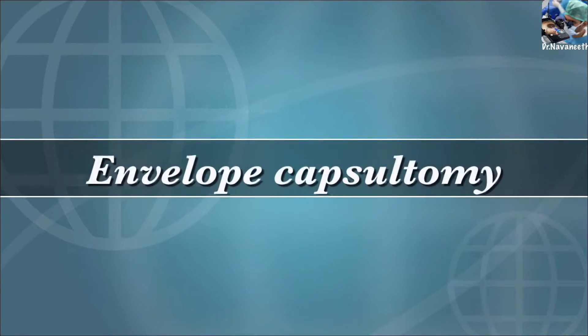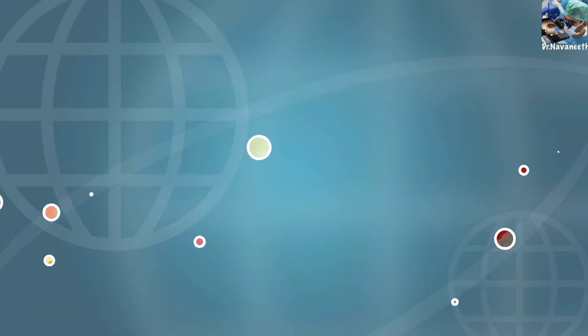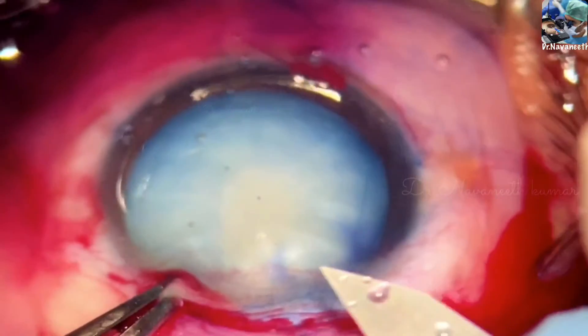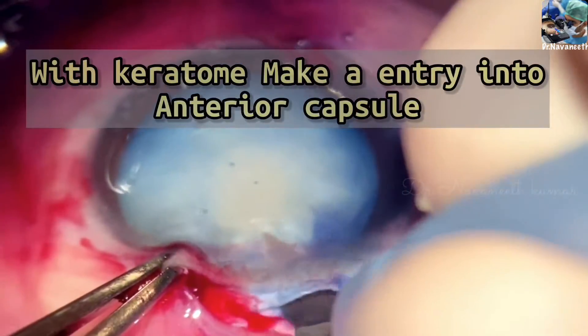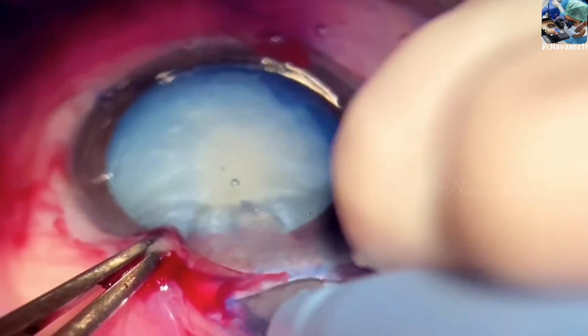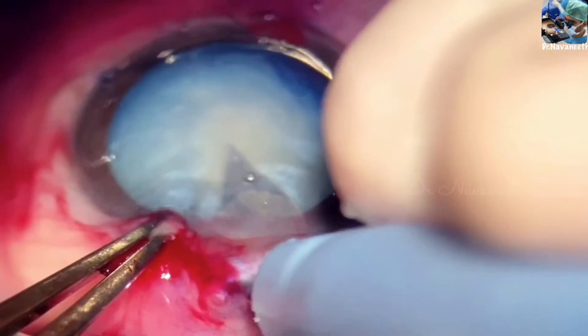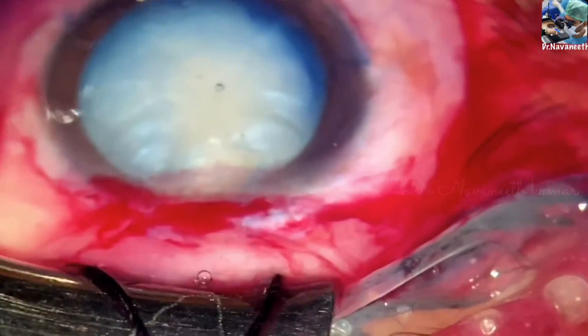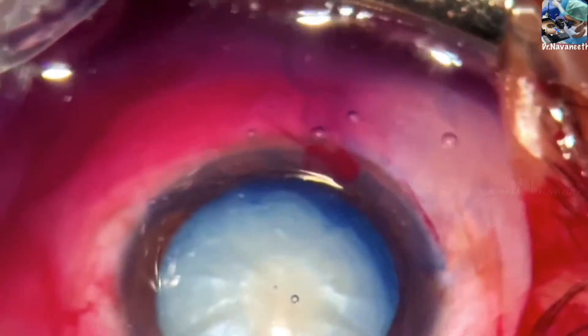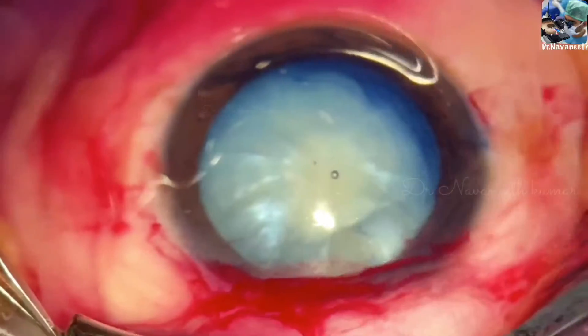Envelope capsulotomy can be the preferred method of choice in traumatic cataract with intumescence and a weaker zonule. Here, the superior capsule is entered with a keratome to prevent inferior extension of capsular tear and to preserve inferior capsular support for IOL placement.